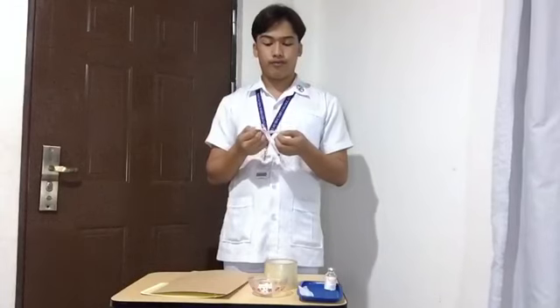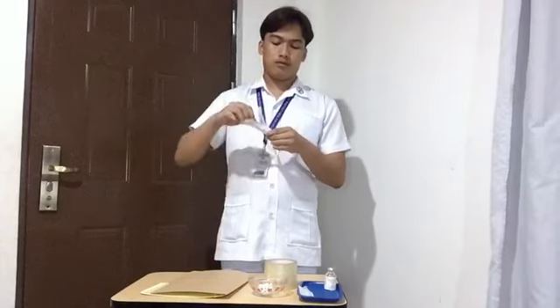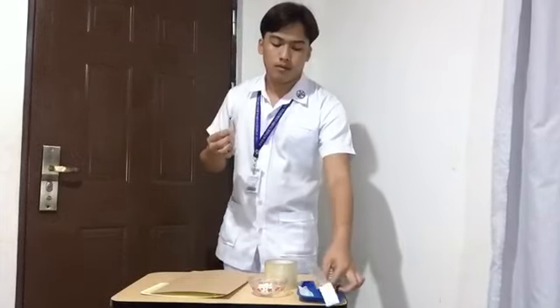So first is attach a filter needle, as agency practice dictates, to draw up premixed liquid medication from the multi-dose vials. So first, I am going to open the tuberculin syringe. And I am going to insert the filter needle.